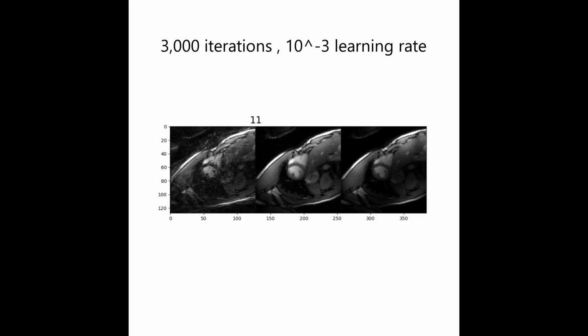This is the dynamic reconstruction of the cardiac cine MRI. As I explained earlier, far left is the highly aliased input, in the middle is our reconstruction, and on the far right is the ground truth. You can clearly see how the network successfully suppresses the undersampling artifacts because of the structural helical manifold we mentioned earlier. The cardiac motion is temporally smooth and consistent, with highly accurate anatomical boundaries compared to the ground truth.